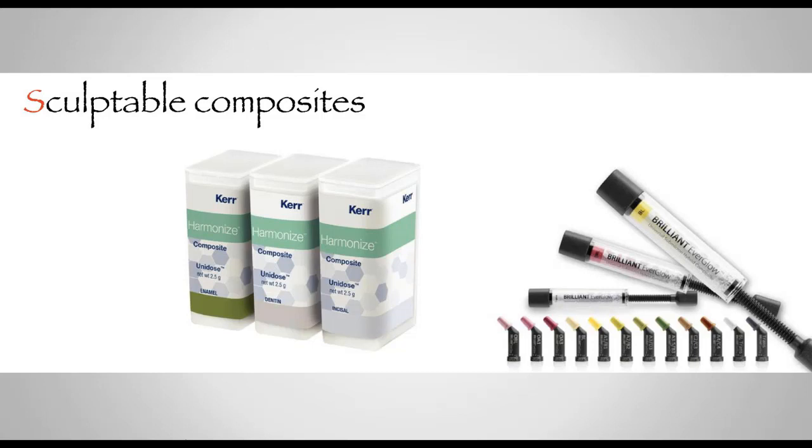The only thing that you would have to do for these composites, in order for you to be able to deliver them into the clear matrix and triad tray that we have to fabricate, is warm up the composites. So I personally have a composite warmer in my practice made by Addent, and what I do is I just insert my compules into the warmer. The warmer brings up the temperature within the compule all the way up to 151 Fahrenheit, making the composite very flowable. So even though it's a sculptable composite, it is easy for you to inject within the clear PVS and then sculpt in the clear PVS before you seat it directly into the patient's mouth.